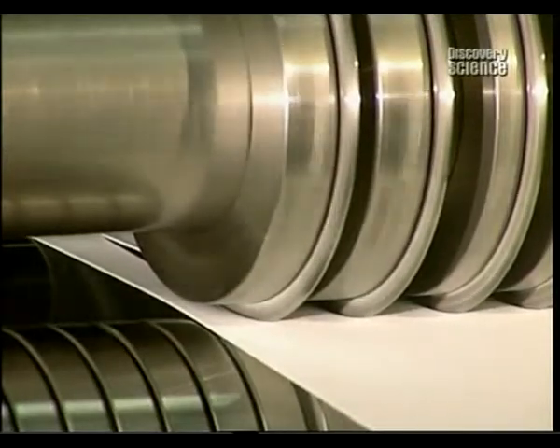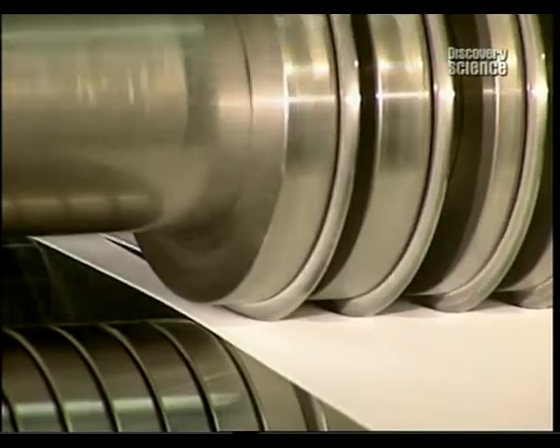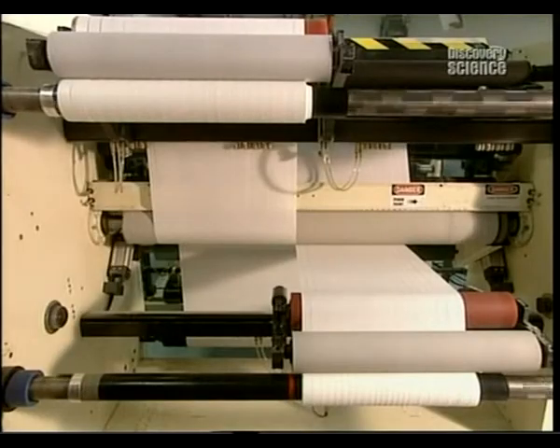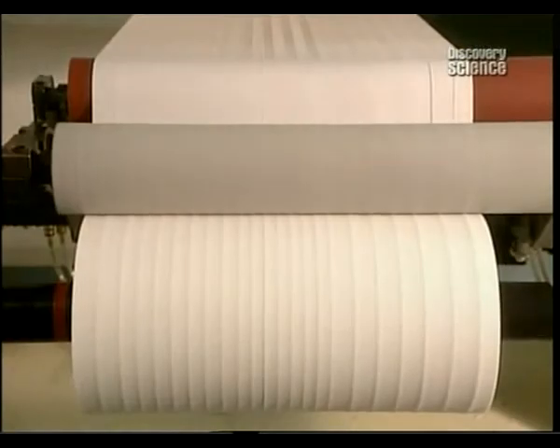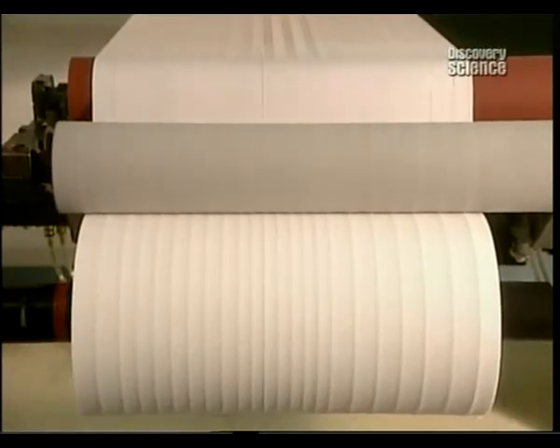A machine cuts the fabric pads with finely honed blades that are sharpened every 6 months. The cushioned fabric is separated into narrow strips, which will later be glued to the ETS fabric. The strips are now ready to be applied to the bandages.